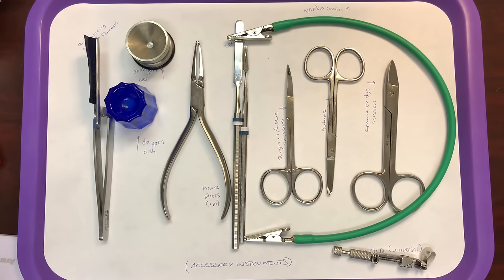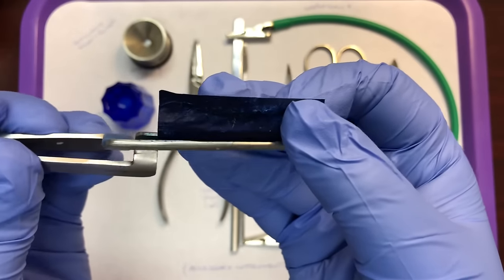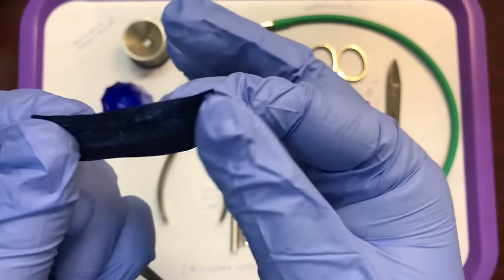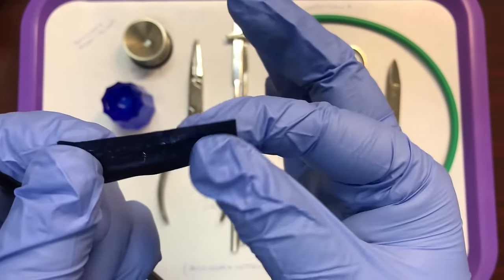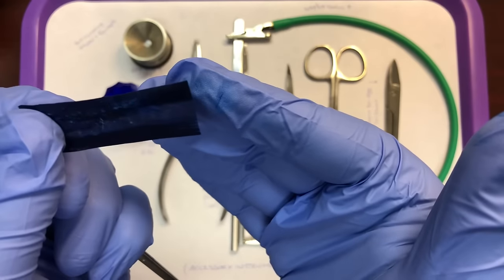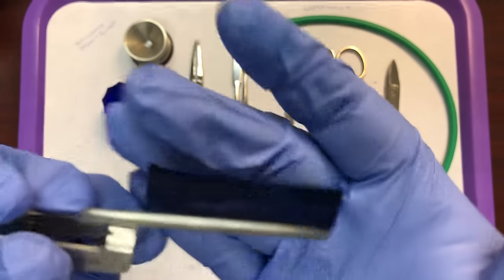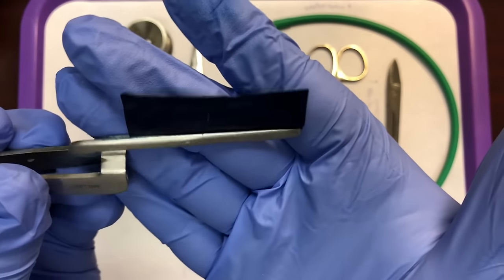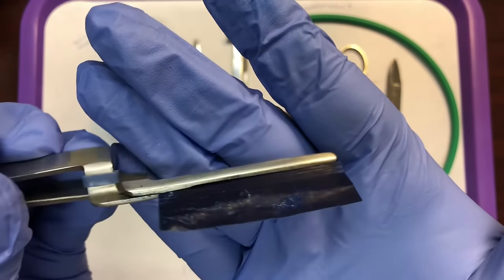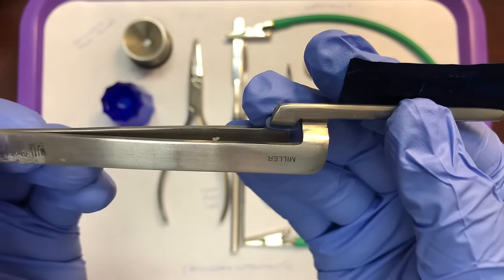For our accessories, we have articulating paper and an articulating paper holder. You squeeze the handle, the beaks open up, and you can remove the paper, which is a marking or carbon paper that leaves a mark when rubbed. When a patient has an occlusal filling, we want to make sure it's not too high — the patient bites on the paper and it leaves blue spots on their teeth. If there are heavy blue spots on the occlusal surface, the doctor trims it down. Articulating paper and articulating paper forceps work together.